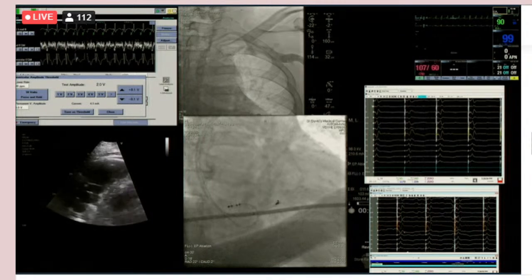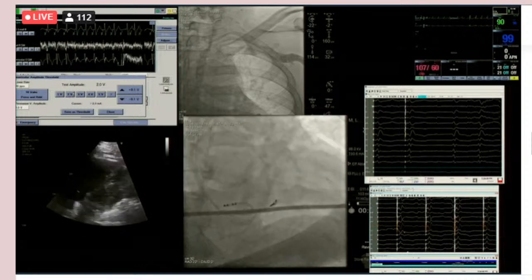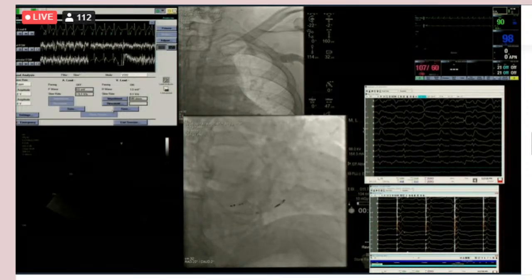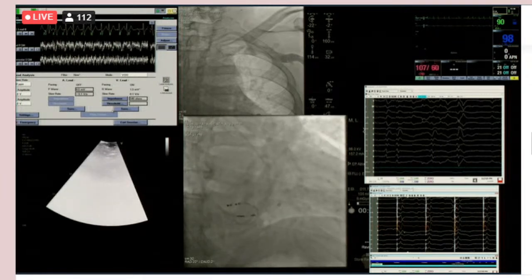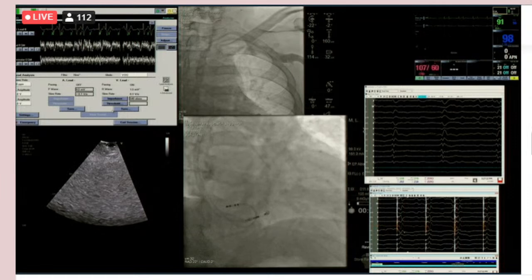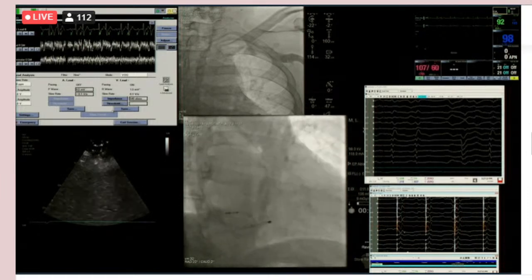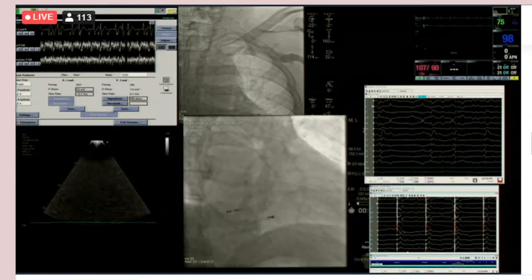Okay, go to 2. There's 2. Okay, it's gotten worse. I'm going to go ahead and start over. Again, you just have to be a little bit of a perfectionist on this. A little bit. I sort of know where I want to go, so leave it right there. It looks like you made a very small move there, because it looked like the spot you were in had a nice narrow QRS. You didn't have to move too much. No, I didn't want to move too much. It's a good spot.